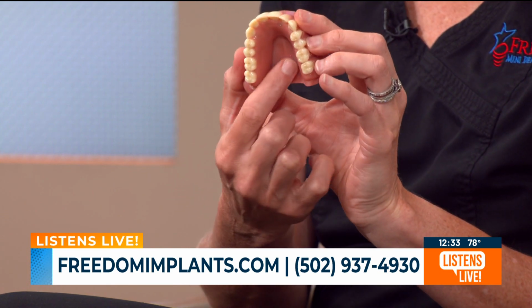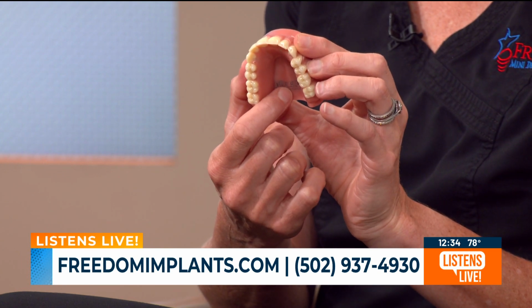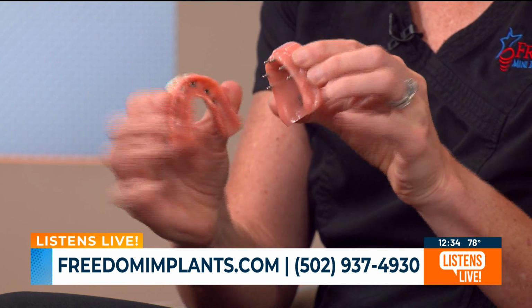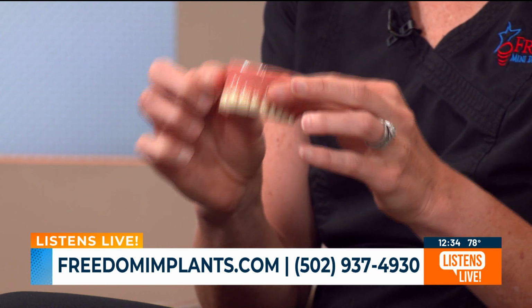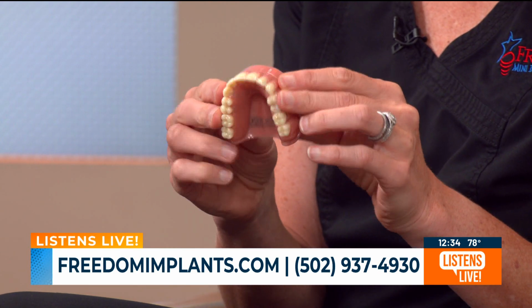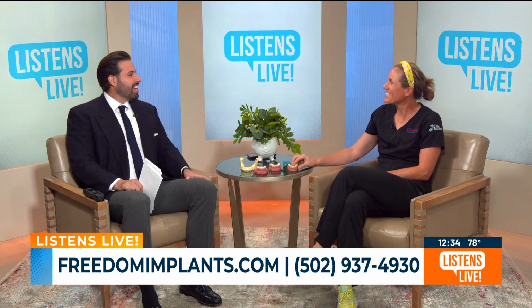If you're a gagger, a lot of times we can trim some of that off the roof of the mouth to help with that gaggy feel. And then you'll wear the dentures 24/7, but you'll snap them out once a day, rinse and clean them, snap them back in. Don't have to deal with gobs of denture glue anymore. You can eat better, eat that steak again, all that food that you've been missing. It's one of those things that you've had patients tell you it's been life-changing for them.